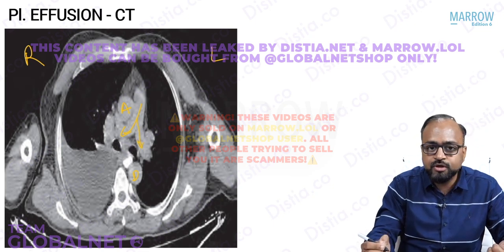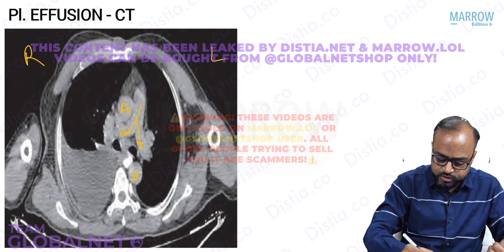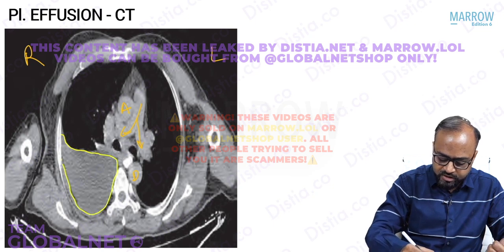Now, if you look at this particular image here, in this image, look in the right hemithorax. Can you see this slightly hypodense appearing, hypo to isodense appearing area there. What is this?